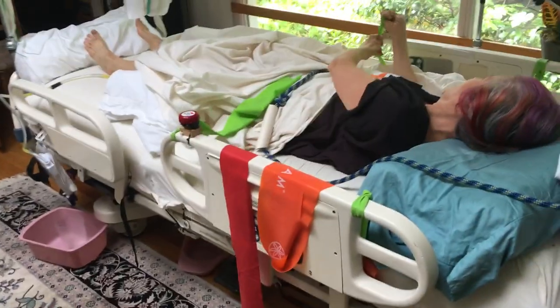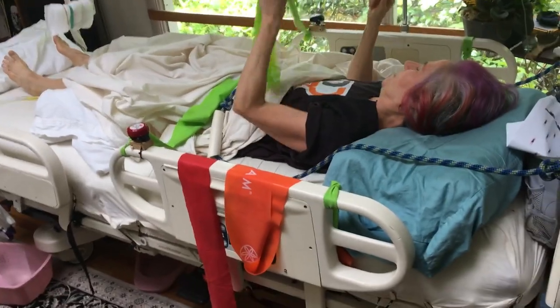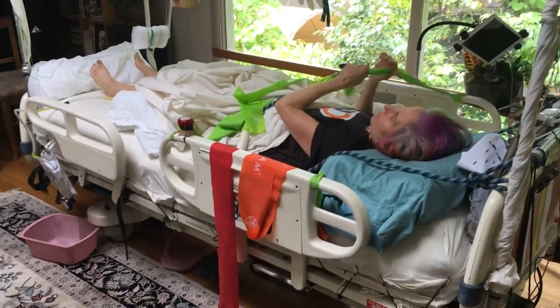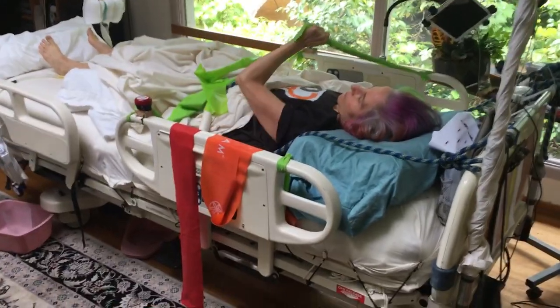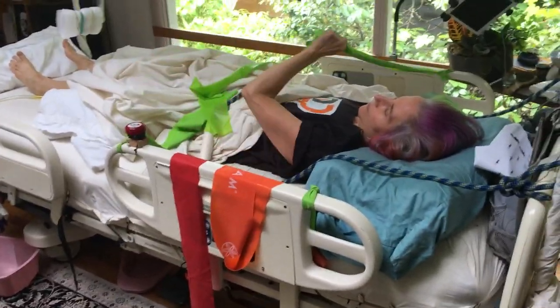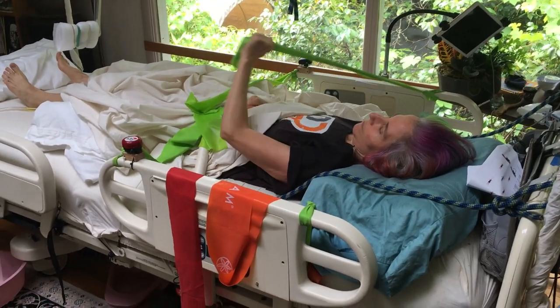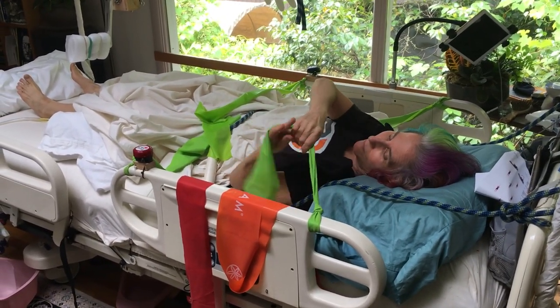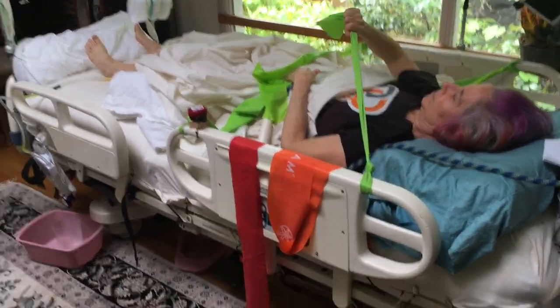This bed is a classic Stryker bed. You might say we can't afford that, but it turns out you can get these on eBay for about $450. It's a $12,000 bed with wonderful capability, and they're being surplused out of the Veterans Administration right now — a wonderful opportunity for a really good quality home bed.